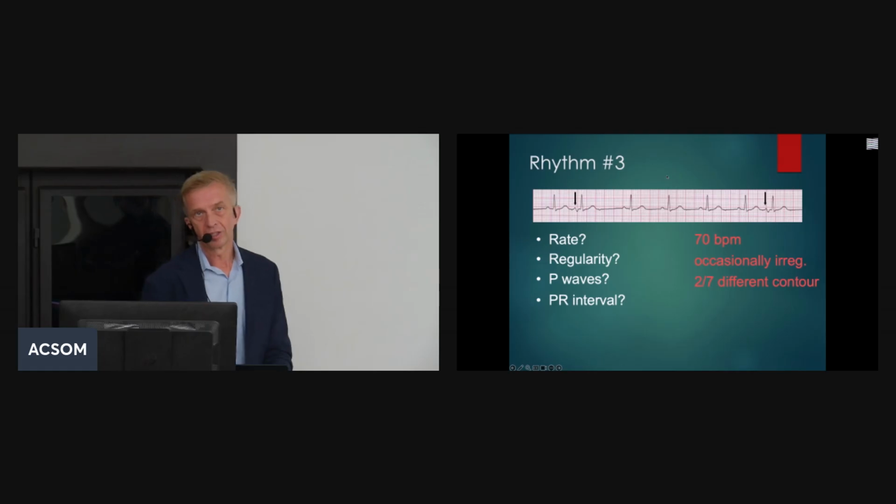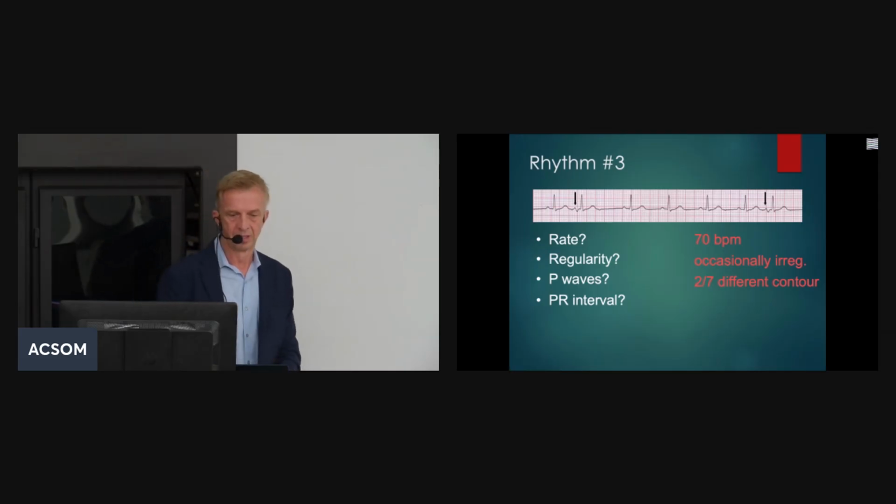Because the atrial tissue is still refractory. Atrial tissue is not able to be depolarized when the next electrical impulse comes too early after the PAC. So there is no atrial activity, because the atrial tissue is still in the refractory period. We'll talk about the refractory period tomorrow when we talk about physiology.